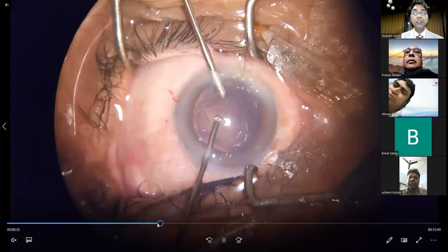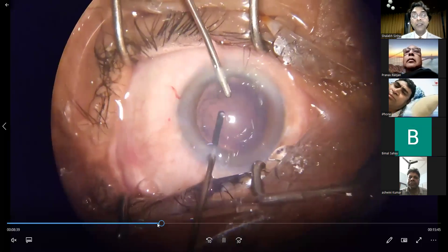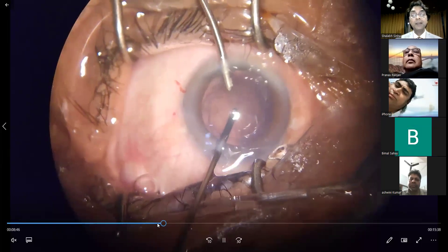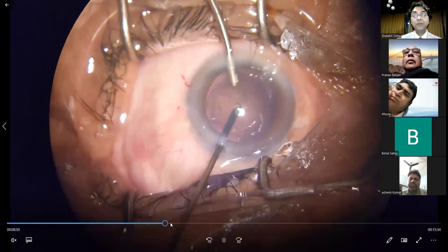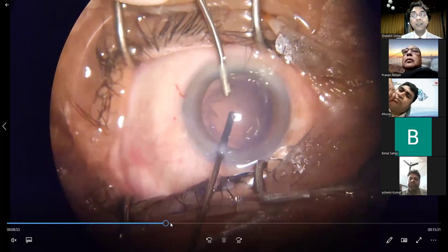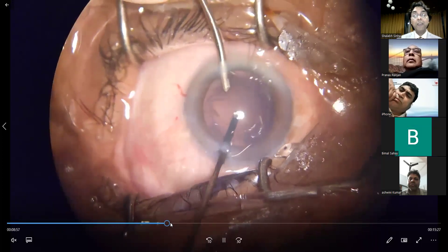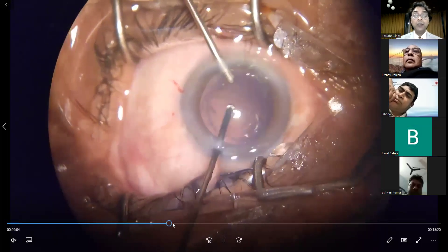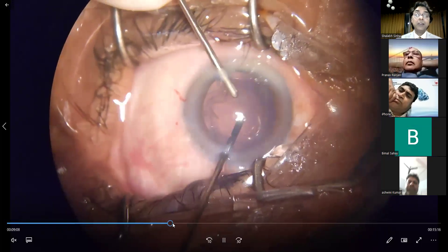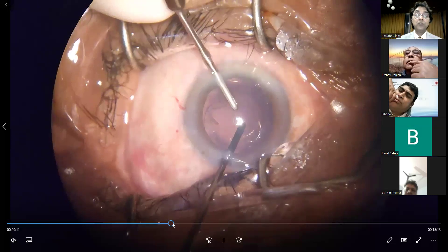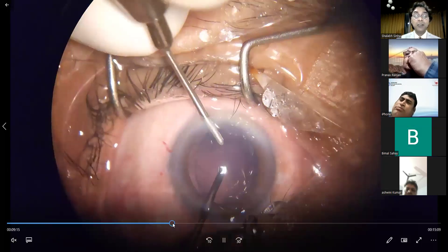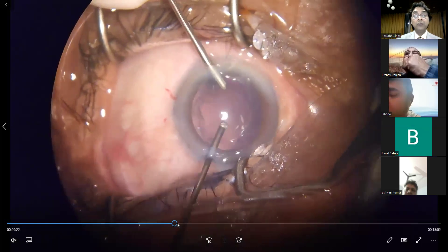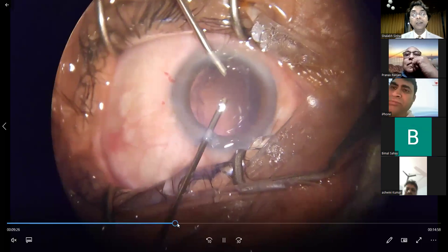The cutter is introduced into the eye in the area of the rent and turned slightly sideways to remove whatever vitreous is collapsing into the anterior chamber. Suction on the vitreous should be as low as possible — I try to keep it at 100 — so that I am not pulling too much vitreous; only whatever is there in the anterior chamber. You do not wish to prolapse or bring more vitreous from behind into the anterior chamber.